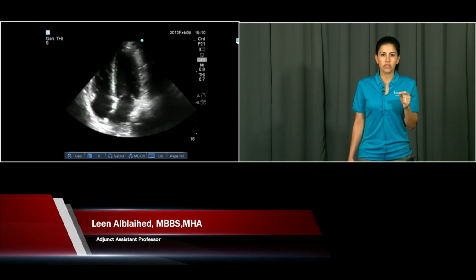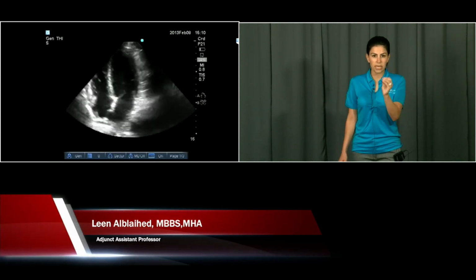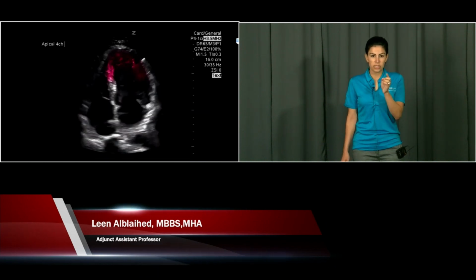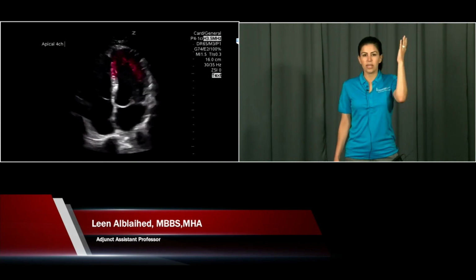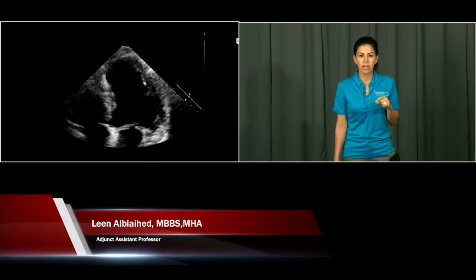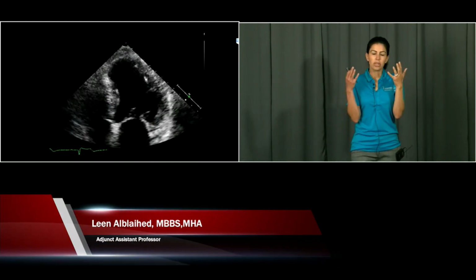So if you look at this, you can notice that the ventricles are squeezing nicely, the walls are thickening, there is no abnormality. When you look at this, you could see that the bases are squeezing, but the apex is not doing anything, the highlighted portion. Same thing here. There's thickening and thinning in the bottom part, not much on the top part.